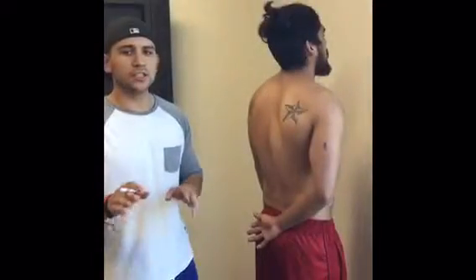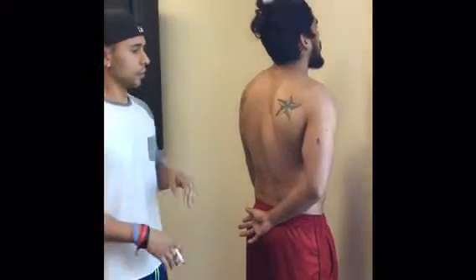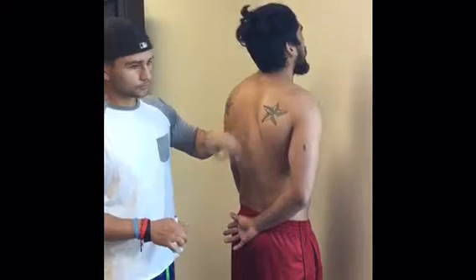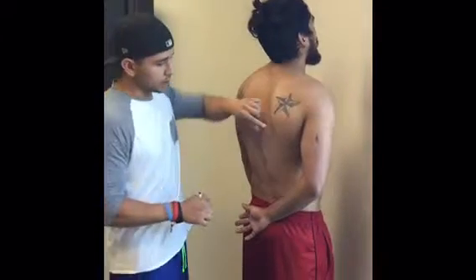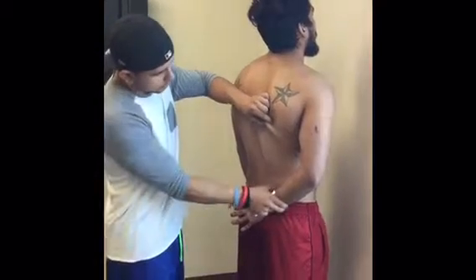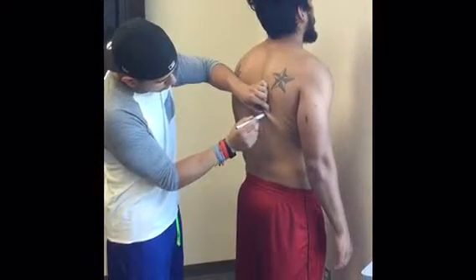Okay guys, so the second site that we're going to be taking for the skin fold assessment is the subscapular. It's a diagonal fold. It's 1 to 2 centimeters below the inferior portion of the scapula. So right about here, drop the arm, right about here. Mark it up.